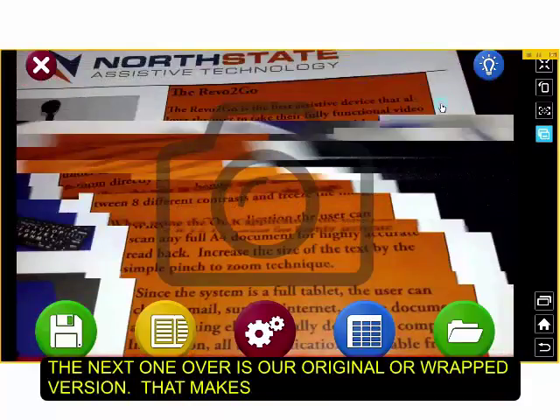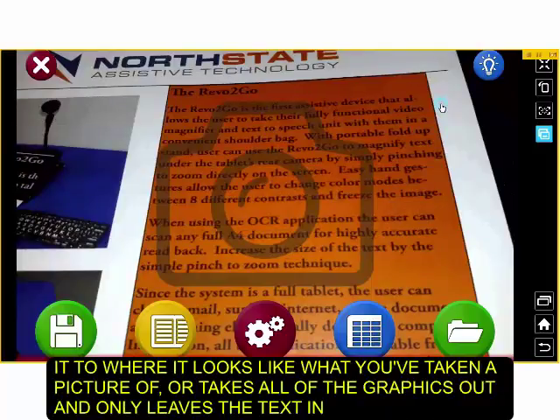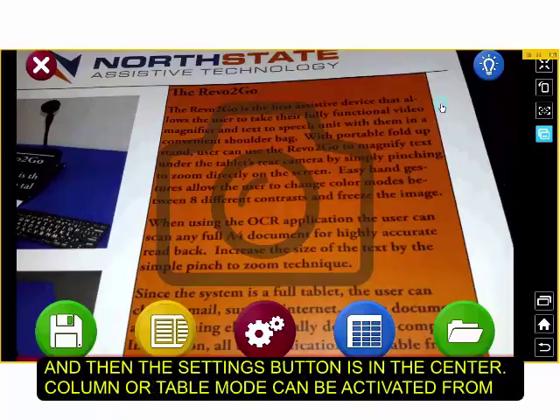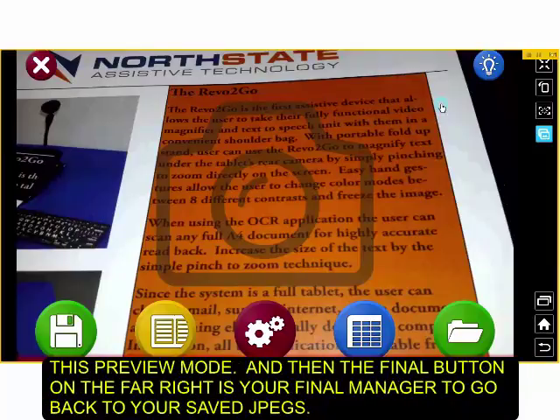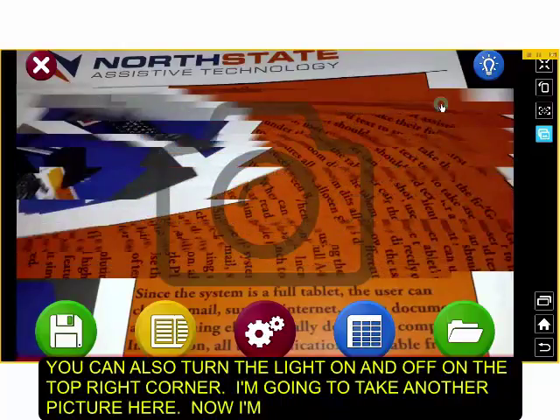The next one over is our original or wrapped version. That makes it to where it looks exactly like what you've just taken a picture of, or takes all of the graphics out and only leaves the text in there. So it's really kind of a personal preference at that point. And then the settings button is in the center. Column or table mode can be activated from this preview mode. And then the final button on the far right is your file manager to go back to your saved JPEGs. You can also turn the light on and off up in the top right corner.